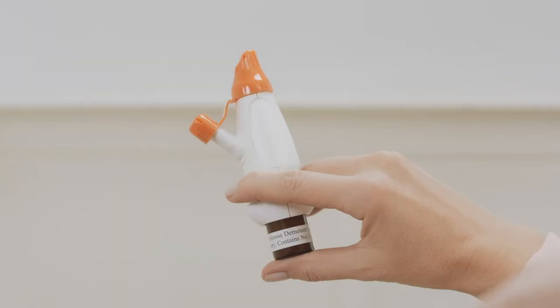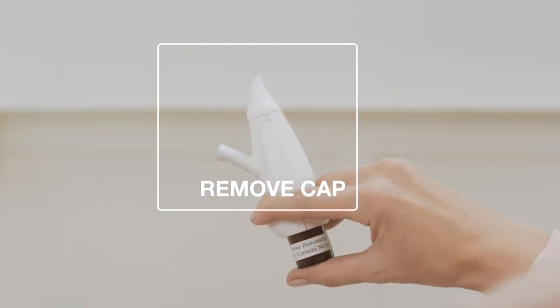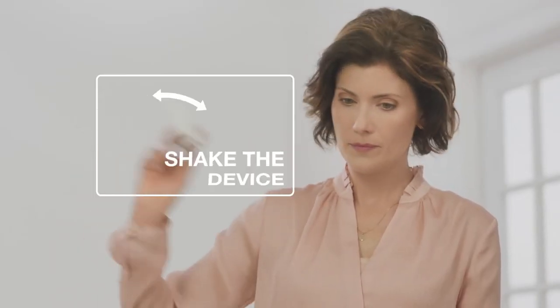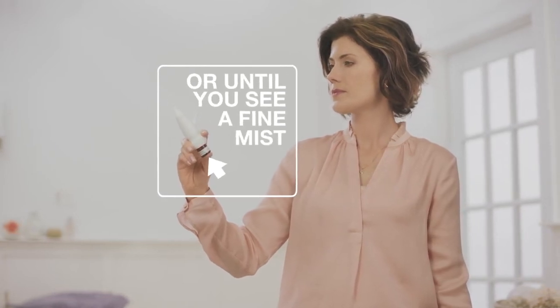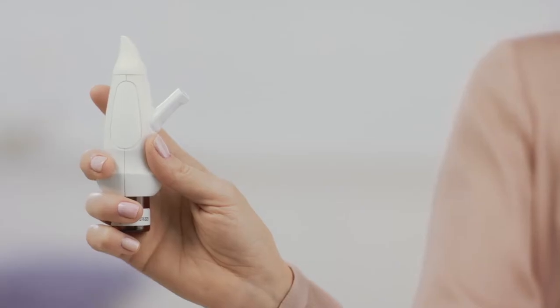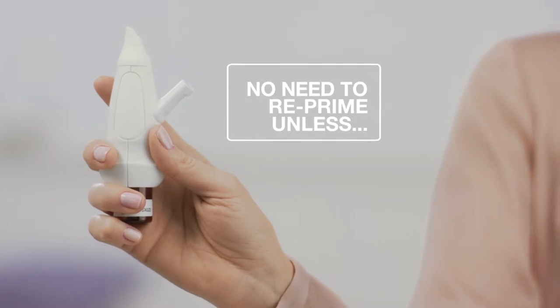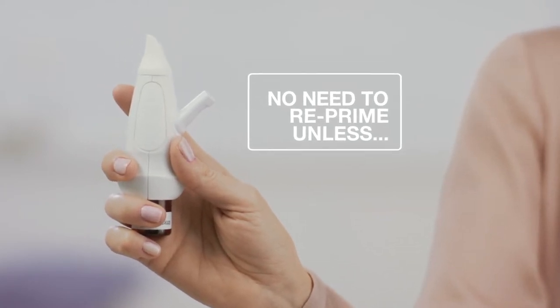Getting Exhanse ready is easy. Before you use a new Exhanse for the first time, you have to prime it. First, remove the cap. Then, give the device a good shake. Next, pump the bottle seven times or until you see a fine mist. After priming Exhanse for the first time, you do not need to prime it again. If, however, you have not used Exhanse for seven or more days, reprime Exhanse by spraying two times.